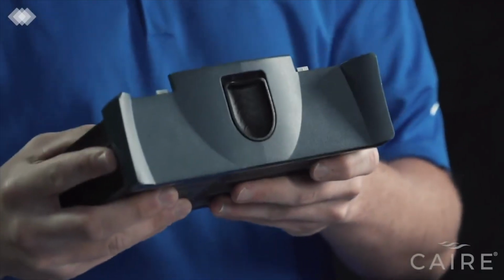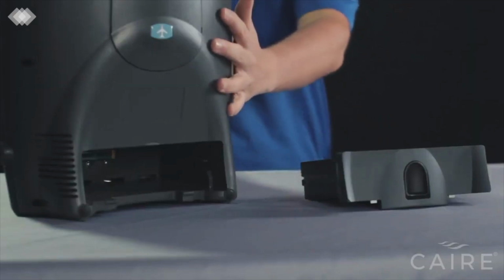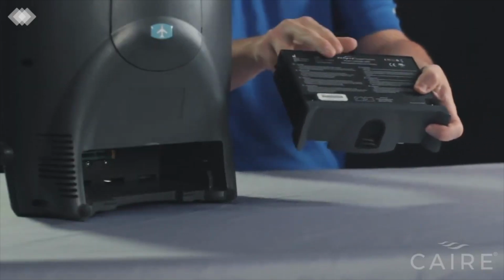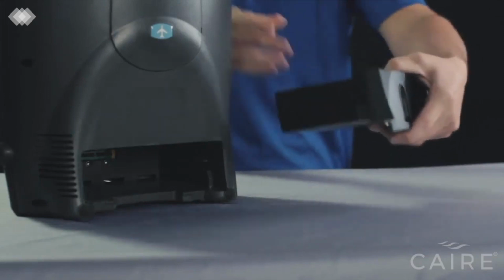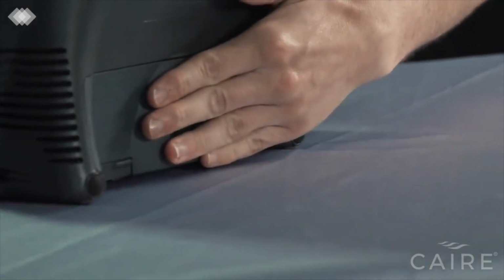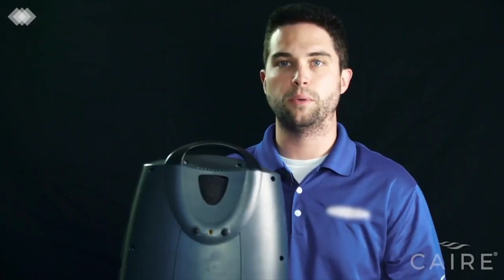The third power component that you'll find is the power cartridge or battery. This is installed into the back of the Eclipse 5 and is used for portability. To install the battery pack, make sure that the white text is upright. Then take the battery and slide it in gently to the back of the machine. You'll hear a click when everything installs properly. Now your battery is installed and ready to use.